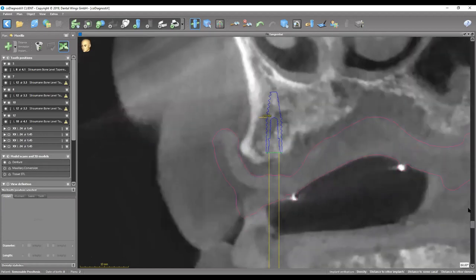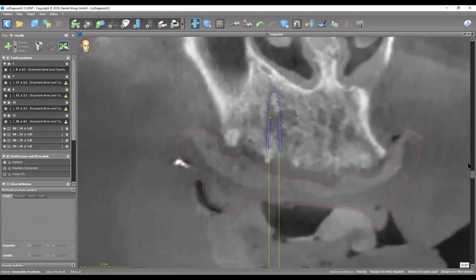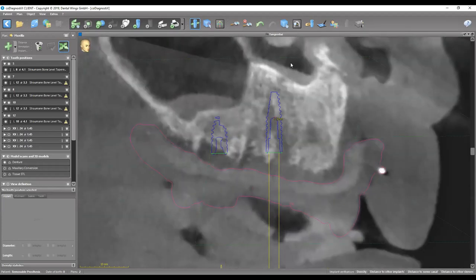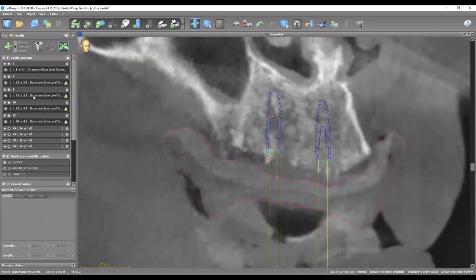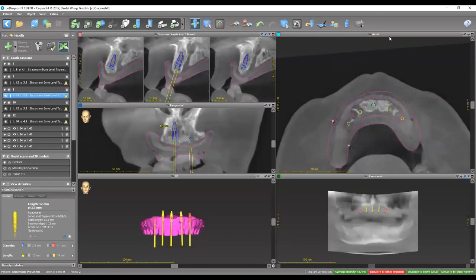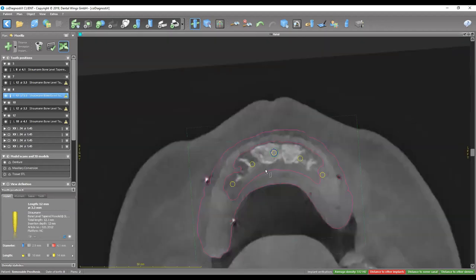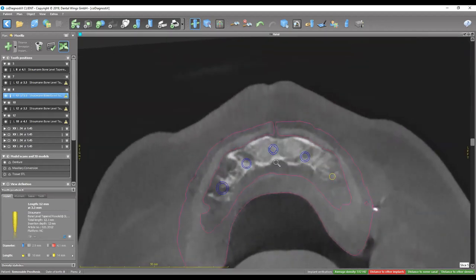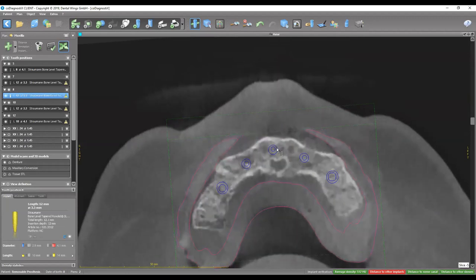Rotating around the implant, making sure it's not close to any vital structures — the nasal cavity is completely away and also away from the medial wall of the sinus. We did add one more implant in the midline and want to show how this looks from the axial view. That implant is in the midline, buccal to the nasopalatine. As long as we're not encroaching on the nerve, it should be okay.